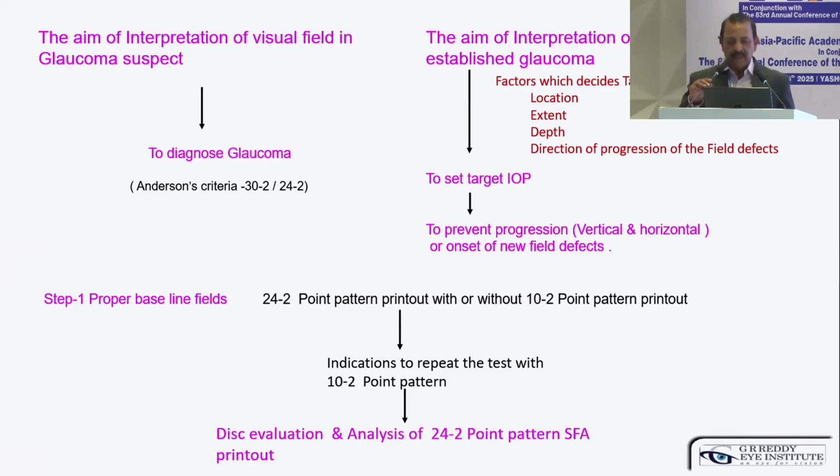At the onset, my sincere thanks to the Scientific Committee for giving us the instruction course. My talk is on interpretation of visual fields related to glaucoma. The aim of interpretation of visual field in a glaucoma suspect is to diagnose glaucoma.